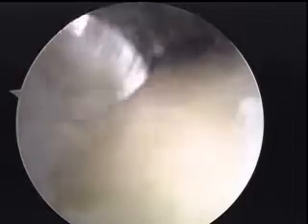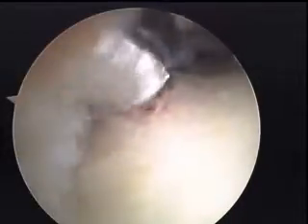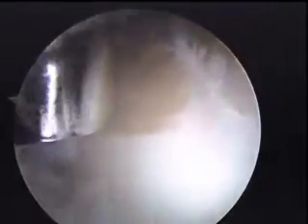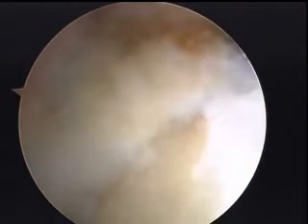Change our camera angle here so we can continue our osteoplasty down the neck. And you can almost see right there, we're continuing to go down until we hit part of the periosteum or the capsule of the neck. It's quite a big step off right there from his impingement down to his normal anatomy where his neck is. There's that piece of tissue, we'll need to get that out.